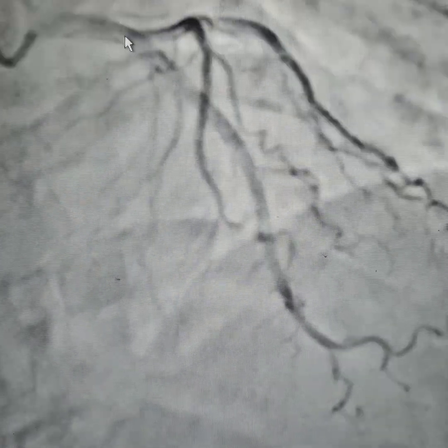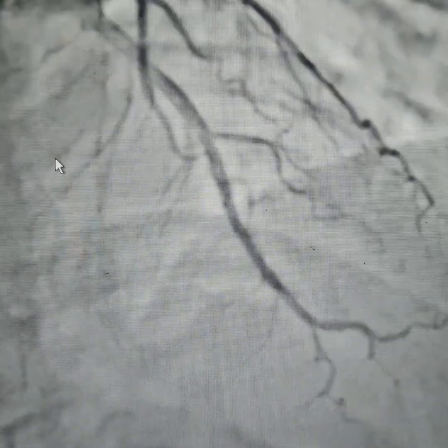This implantation was done about 4.5 years back, and as you can see, the stent is working perfectly. This is the caudal spider view, and again in the cranial view we can see that the stent is working perfectly even after 4.5 years. Just see that there has been no plaque.